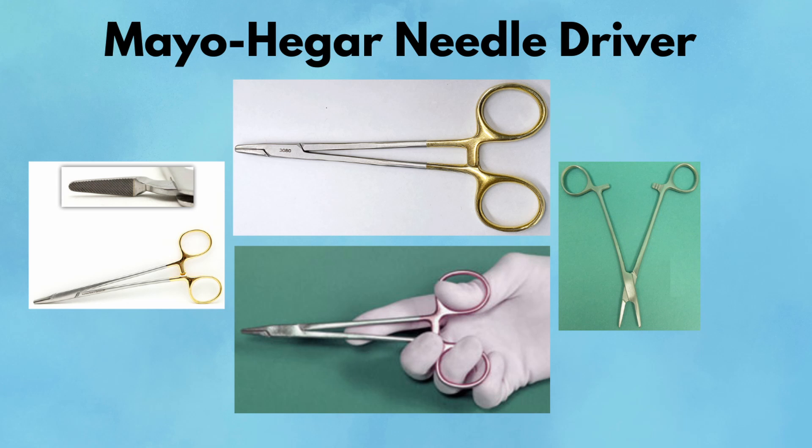Pearl: Excellent for throwing deep sutures during closure. Pitfall: Avoid using with delicate needles — it can warp the curvature or snap them altogether.